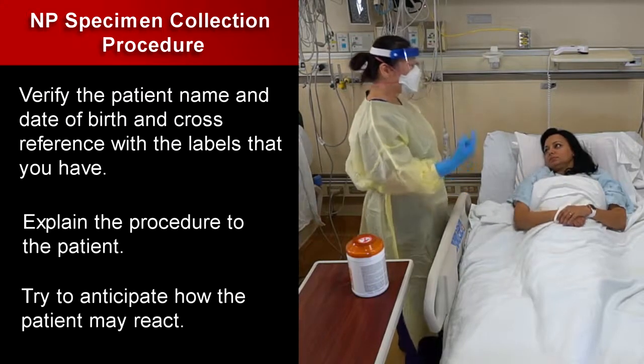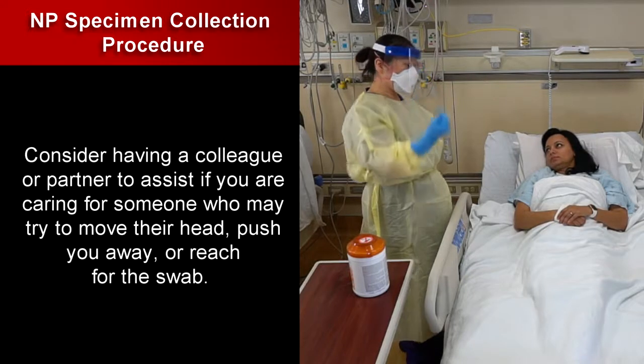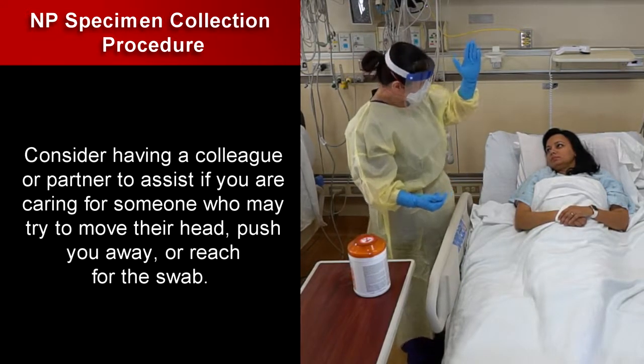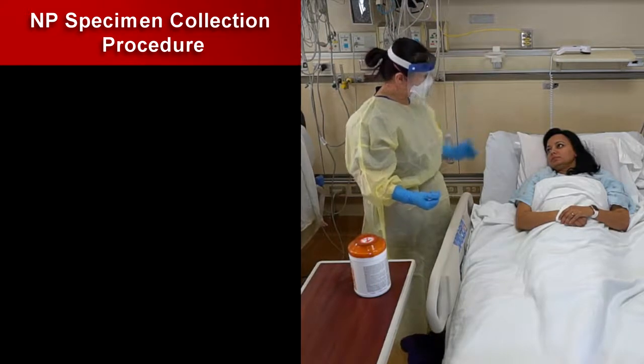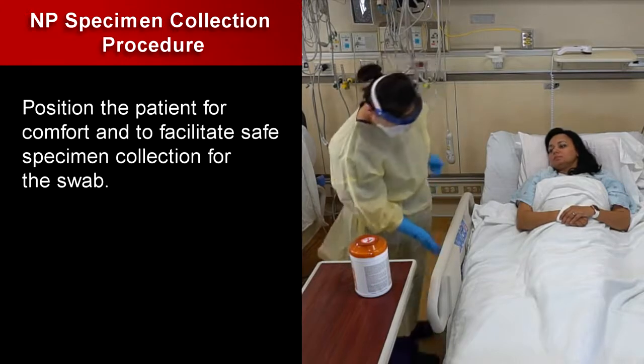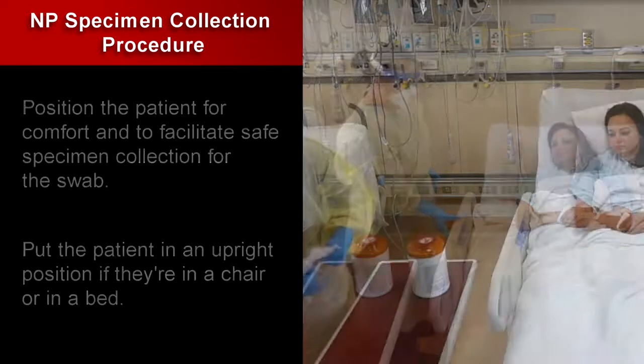Try to anticipate how the patient may react. Consider having a colleague or partner to assist if you are caring for someone who may try to move their head, push you away, or reach for the swab, such as a pediatric patient. Position the patient for comfort and to facilitate safe specimen collection for the swab. Put the patient in an upright position if they're in a chair or in a bed.